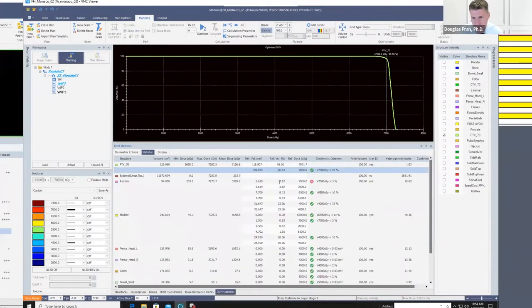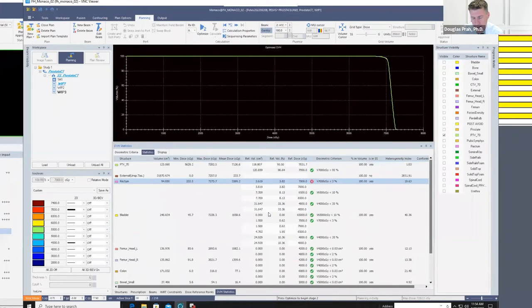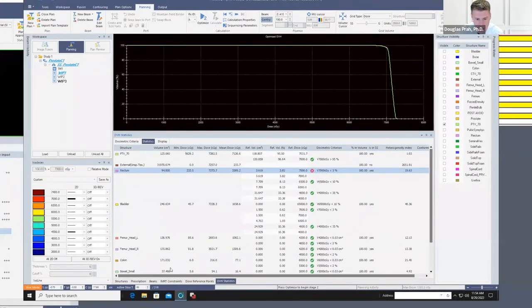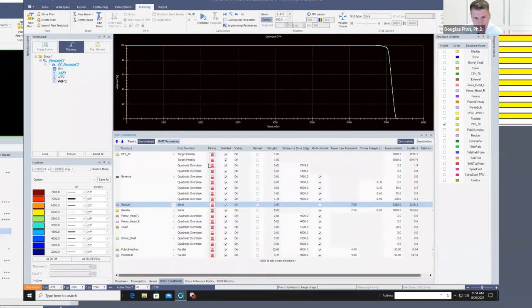So now you can see here, I'm a smidge over on the rectum, this 0.82. So we could probably push that a little more if we need to. I know we're starting to run a little short on time, so I'm not gonna spend too much time worrying about that. So what we can do now in stage two, this is back to that prostate only, is there's two ways to proceed. One way is I could stay in constrain and run it.